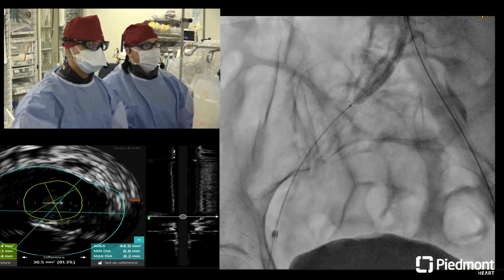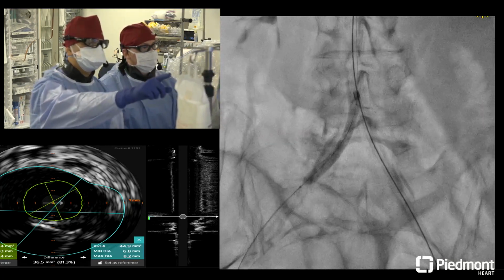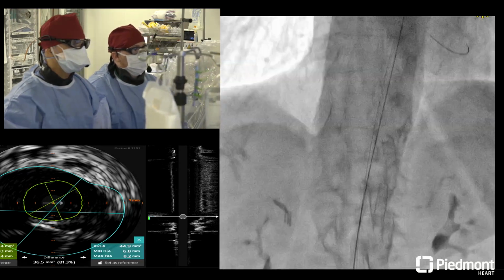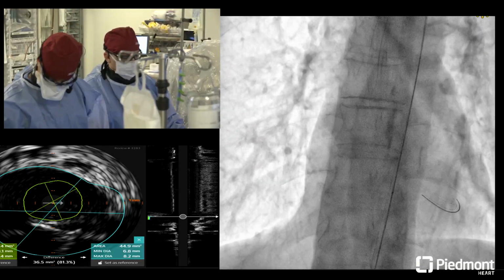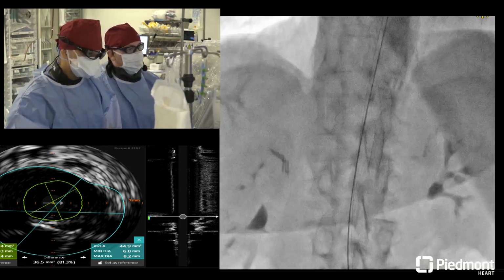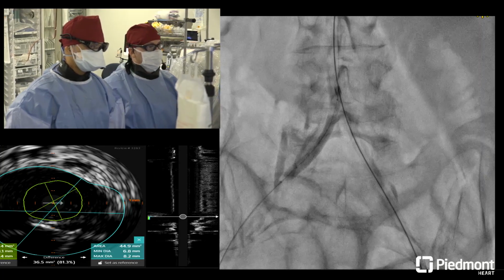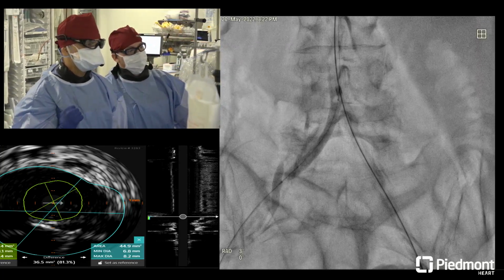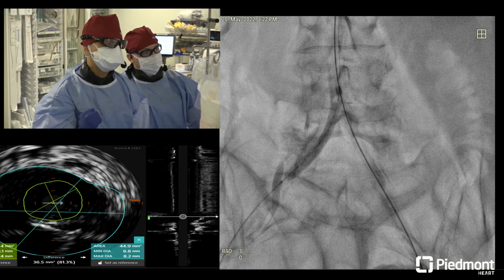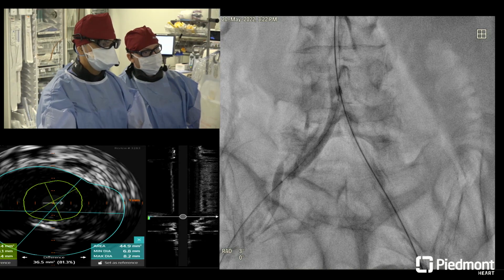Yeah, you can see that resistance. Yeah, it's good. Is the wire in there? Yeah, a little PVC. Yep. Let's pull back the 014 wire. Yep, there we go. So being constantly mindful about where your wire is is critical. Make sure it's not up. And that was the other thing with the reentry: when you reenter, make sure the wire goes up over the arch, because you could technically reenter into the SVC, and it might look a little different then.